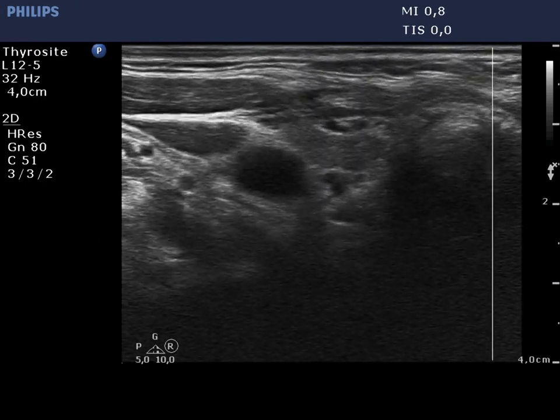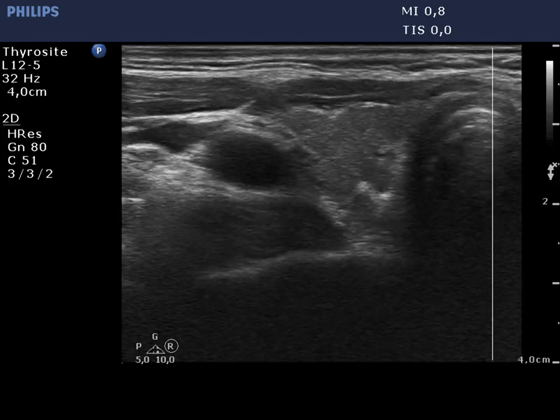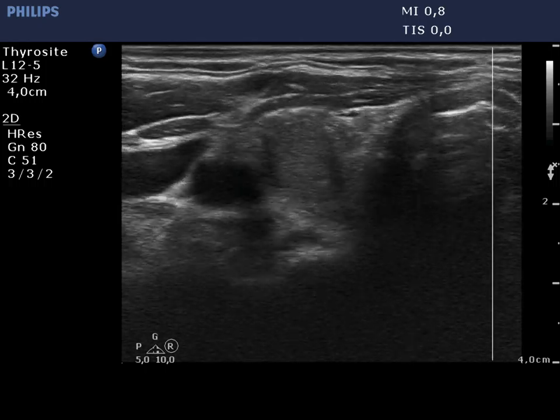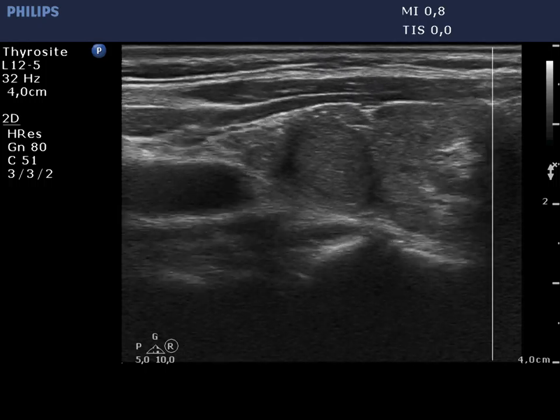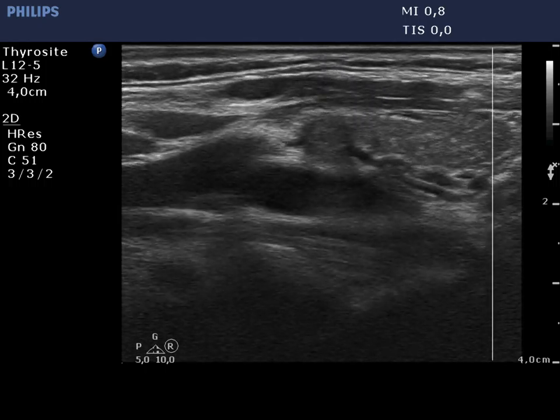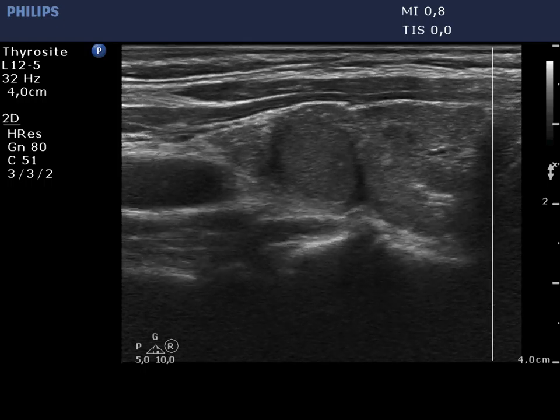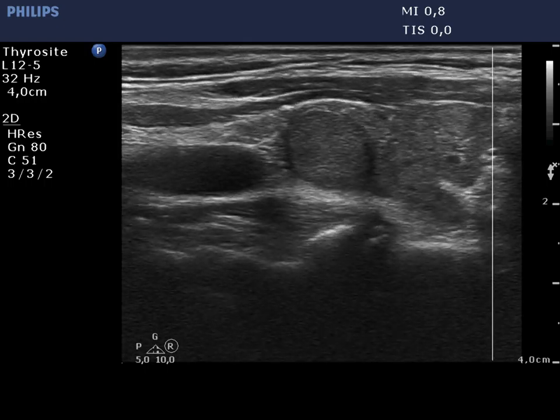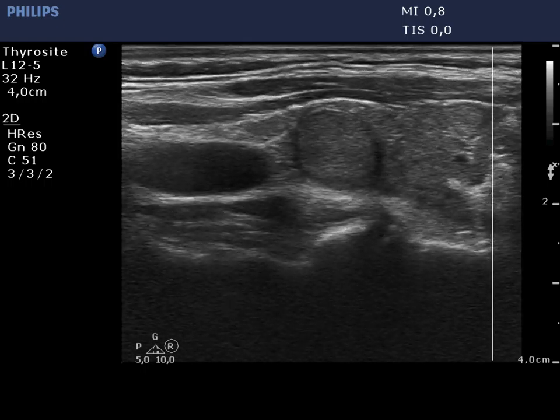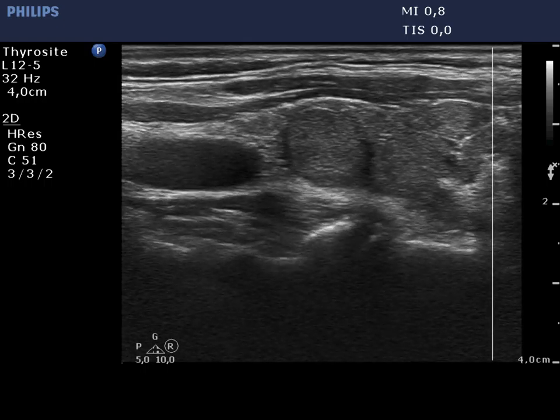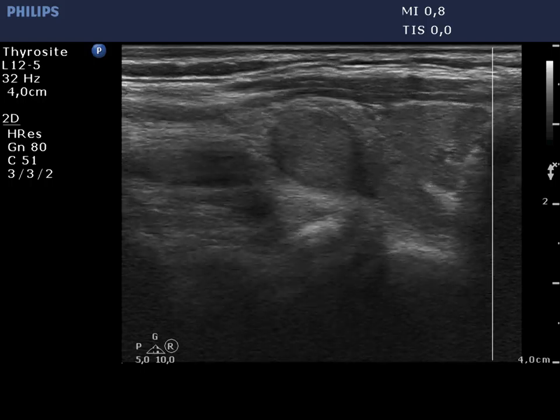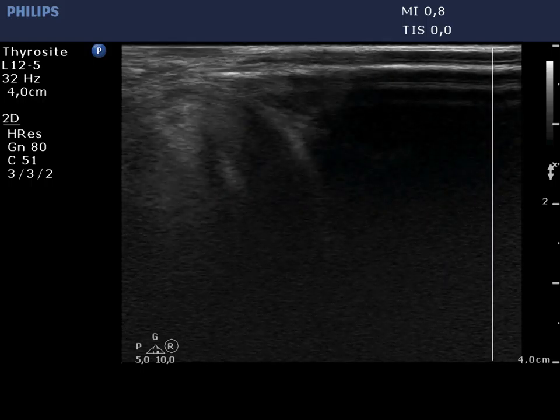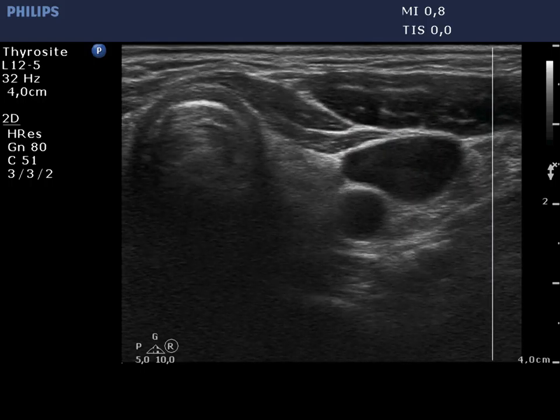The right thyroid is moderately hypoechogenic and inhomogeneous. There is a lesion in the lateral part of the lobe which presents a halo sign. The echo pattern of the lesion is almost identical to that of the extralesional part.